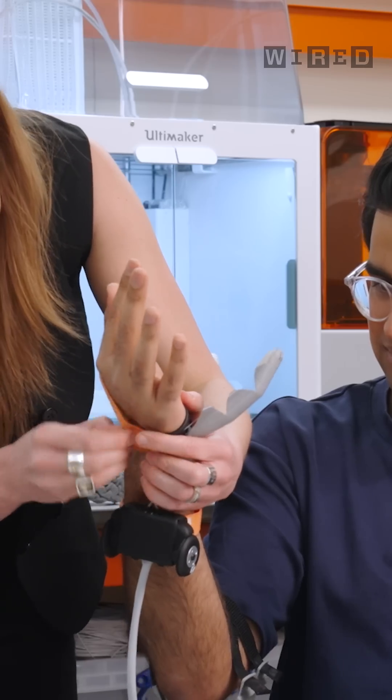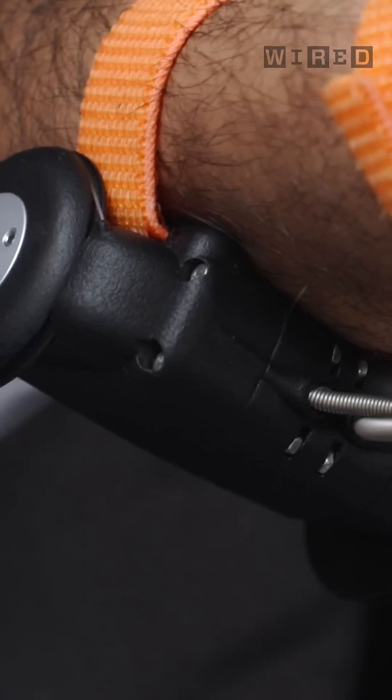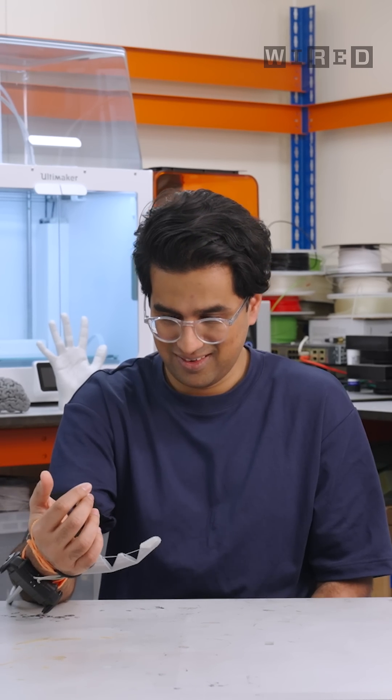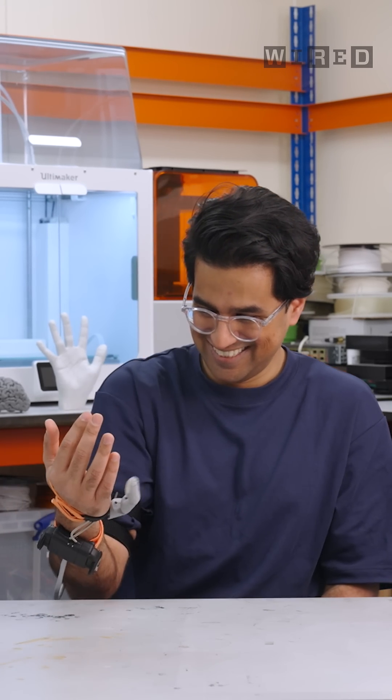Obviously I had to try it for myself. You've got two pressure sensors, one underneath each big toe. It's basically a pulley system — completely flexible 3D print, so it's very compliant. Press your toes down. Whoa! So that's your left toe controlling it. That's so cool. And then your right toe does a press.